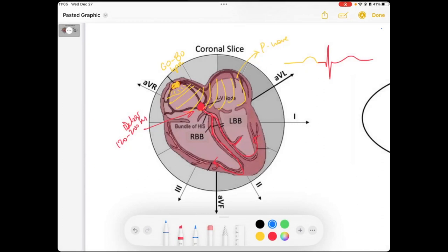The reason I bring up this typical waves of depolarization is because we're going to be talking about PACs today. The P wave, the morphology of the P wave matters. If we look at this coronal slice, we see that our P wave travels from the sinus node down into the left, which means it would create, in lead one, an upward deflection P wave, and in AVF, an upward deflection P wave. That is helpful to make sure that we know that this is coming from the sinus node.